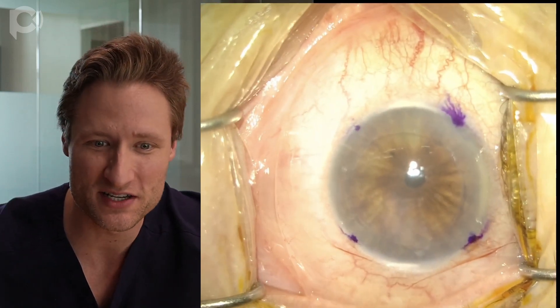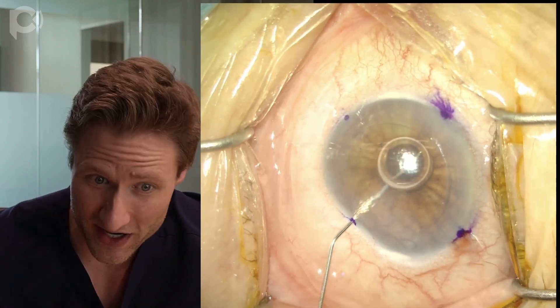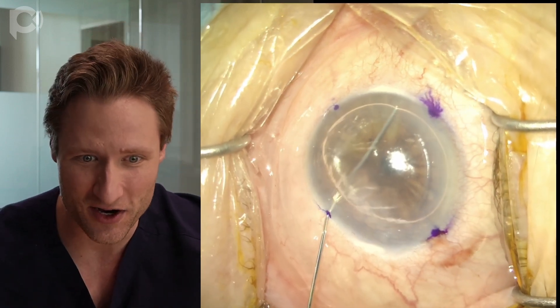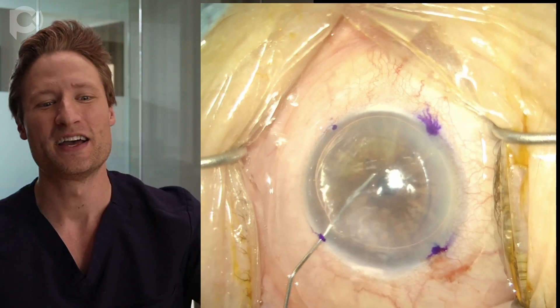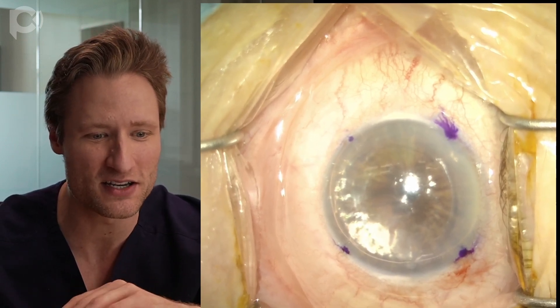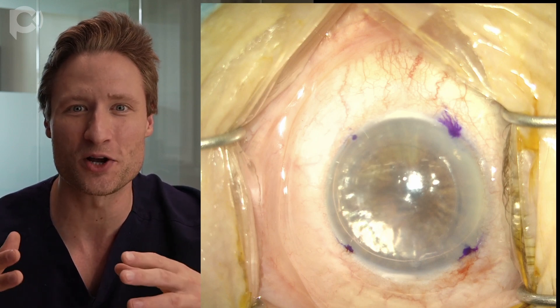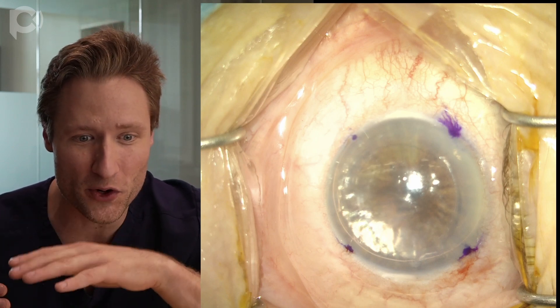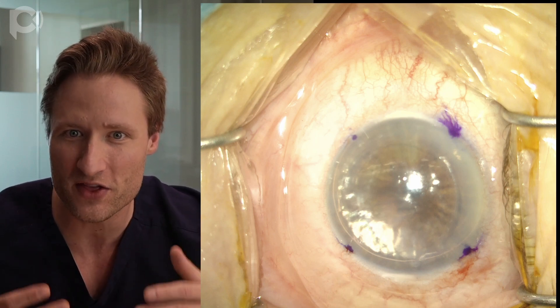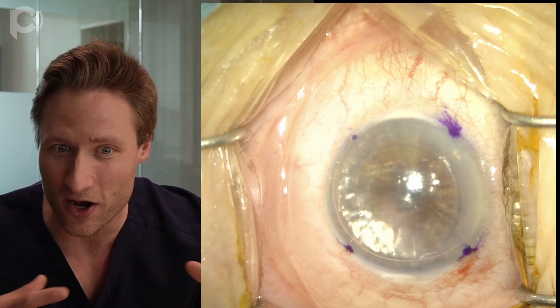I'm marking where I'm going to put my paracenteses — I've got three paracenteses and one extra mark for the descemetorhexis. For descemetorhexis, stripping the Descemet membrane, I like to do it under air. The way we're injecting air into the eye is using a long 27-gauge viscoelastic cannula and depressing the paracentesis while injecting. This evacuates all the aqueous from the anterior chamber, allowing you to replace that fluid volume with air so you can get a 100% air fill.